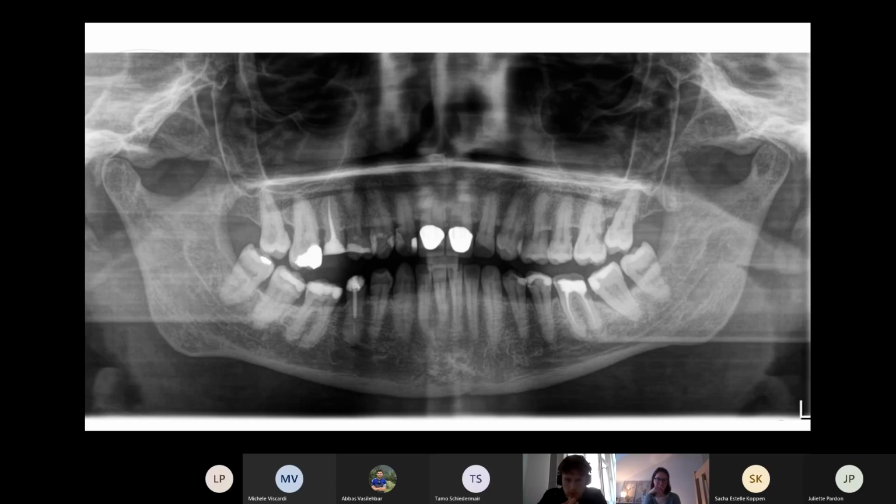Then number 4 is OD. Oh, hang on. Yeah, exactly. So it's also a composite filling, occlusally and distally, maybe a little bit mesially too. Number 3 could be distally glass ionomer or composite. It's also sometimes hard to distinguish. I would say it's glass ionomer mesially and distally. Same in number 2 distally, but mesially you have a composite filling.